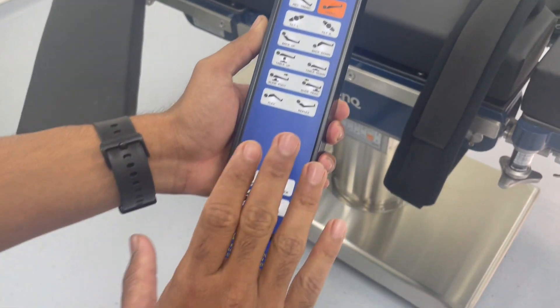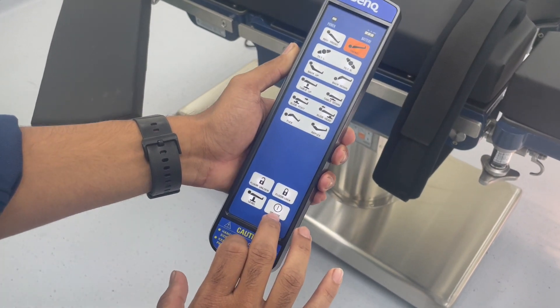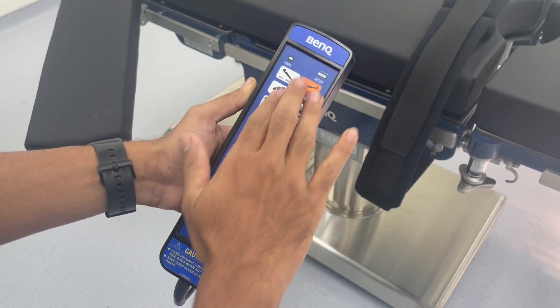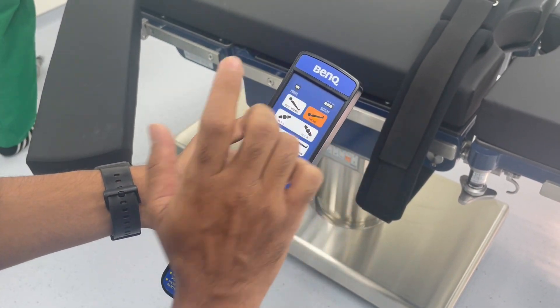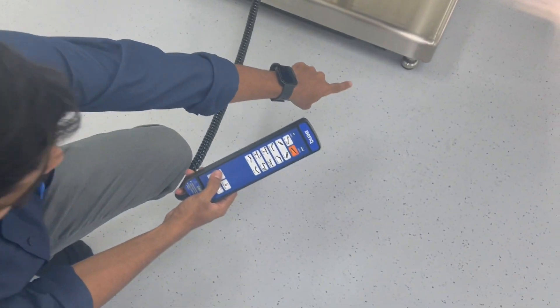This is a general table. First, make sure the remote is in the ON condition so you can see the LED is blinking or glowing in the keypad. Also make sure it is powered or has battery before using the operations.